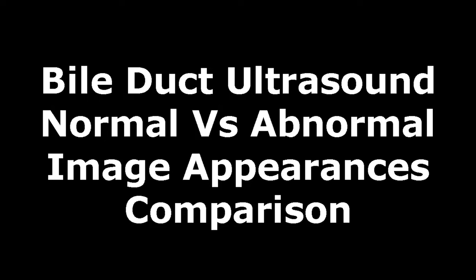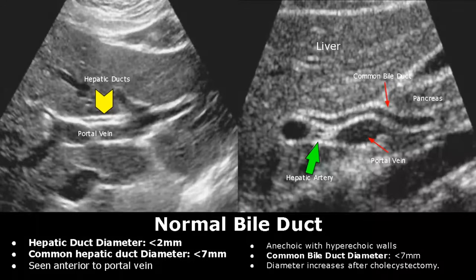Hello everyone, this is Dr. Sam and today we will study bile duct ultrasound. The main bile ducts that we will see are the hepatic ducts or intrahepatic bile ducts and the common bile duct. Here we can see the hepatic duct — it is anterior to the portal vein and is anechoic with hyperechoic walls.